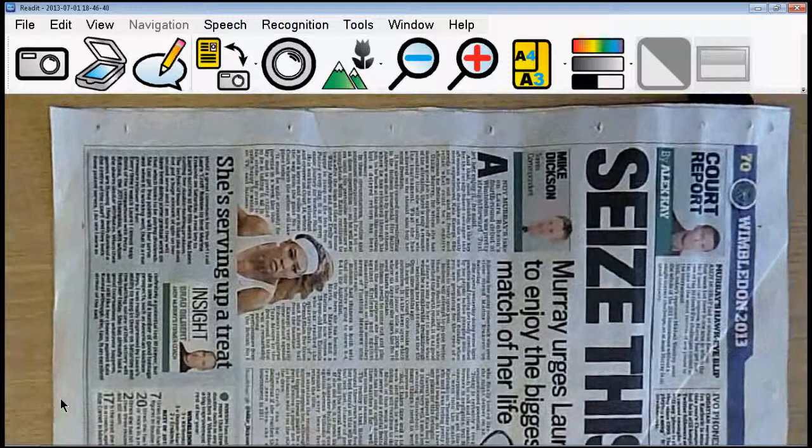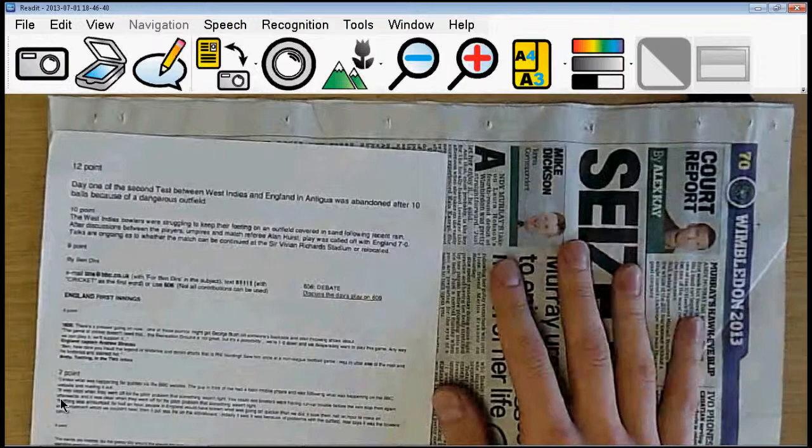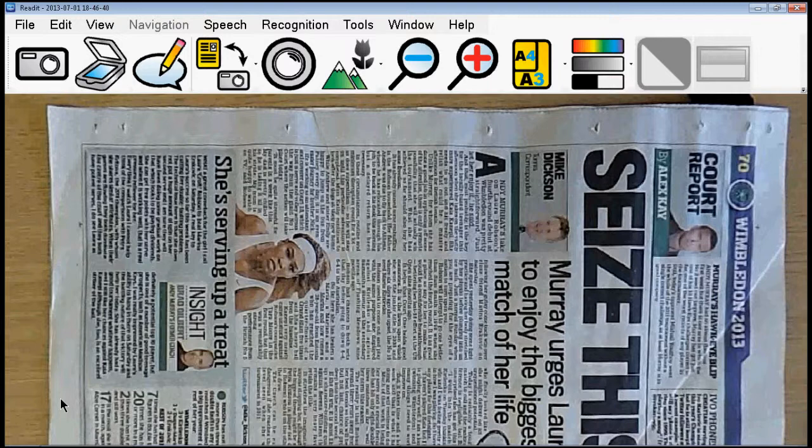We're going to start with one of the Scholar HD's major advantages, and that is its ability to photograph an A3 size document. This is an A4 document under here, so we've got a whole tabloid newspaper size page here. All we do is line it up — on the final unit with the base there will be positioning guides for blind users for both A3 and A4 size document markers, or letter and double letter size for the US. All we do, same as on the old READ-IT software, push enter.